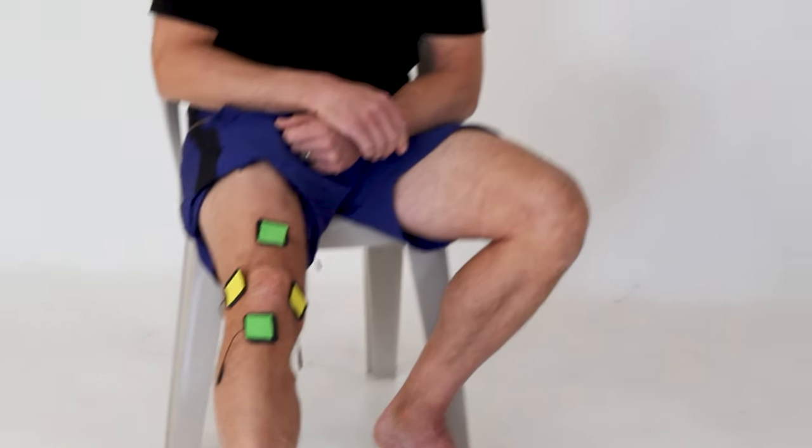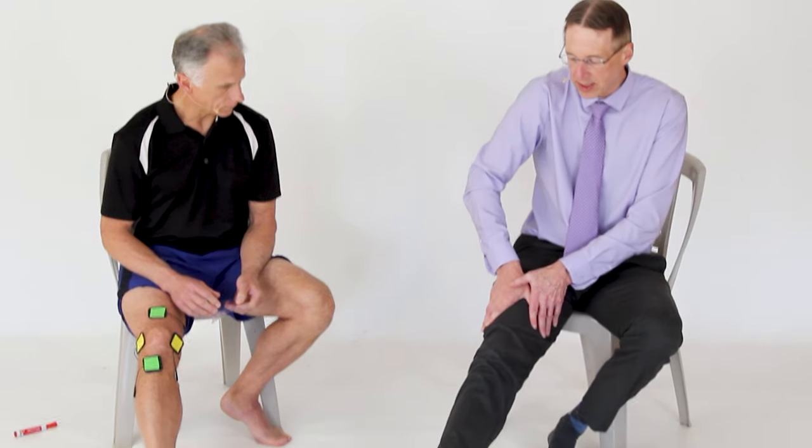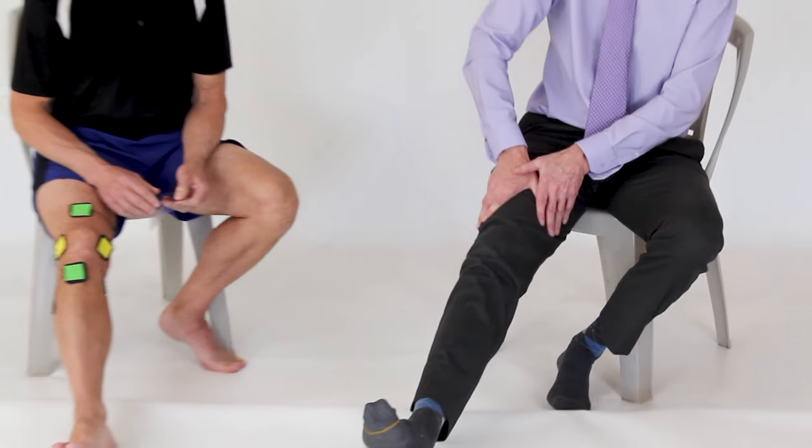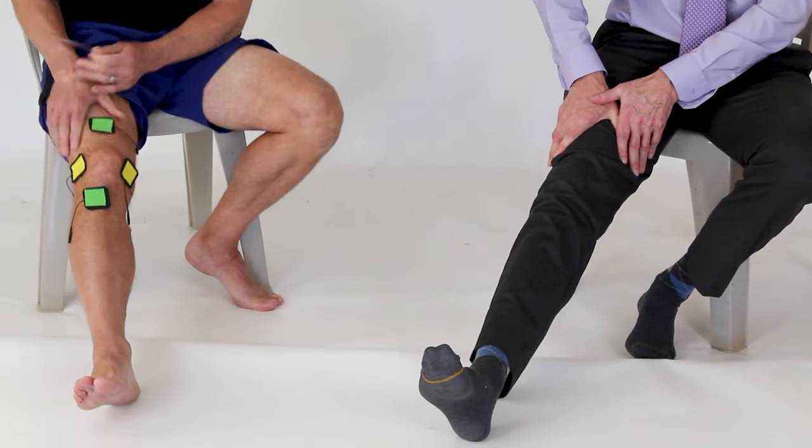We promised one exercise too that you can actually do with these. Especially if your knee is lacking full extension, a lot of times what we find is the more your knee gains back motion, the more the pain goes down. So what you can do is give yourself a little bit of stretch like this into extension, pressure on, pressure off, pressure on, pressure off. You can do that throughout the day.